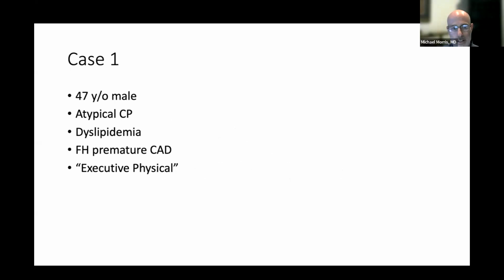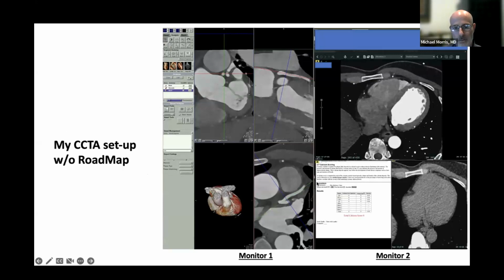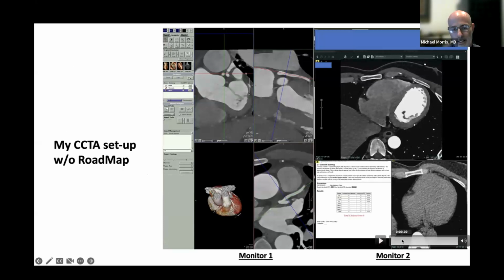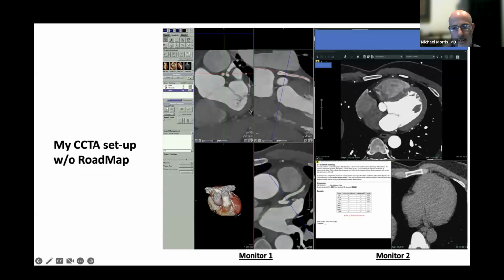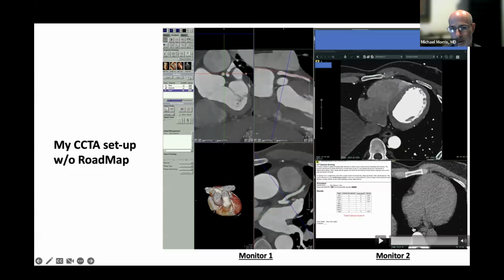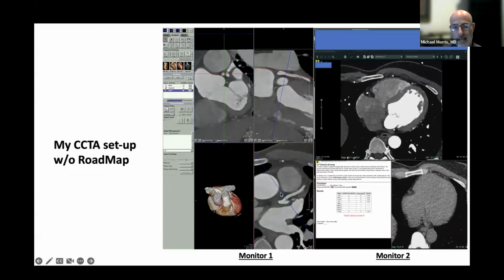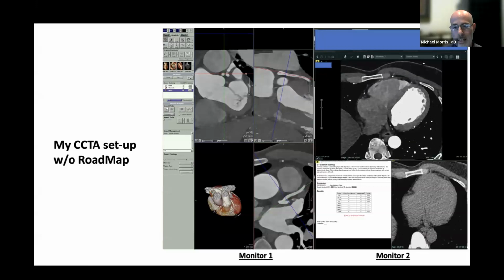And so each of us have our own way of reading coronary CTAs. This is my default for how I start. I first look at the calcium score. Unfortunately, the video is not playing here. And then after that, I will look at the axial images and then go on to the post-processing software. Now, in this particular case, if the video was playing, it would show you that his calcium score was zero, which is great. So I'm already feeling good. But nonetheless, it's still important to review the MPRs, you don't want to miss an occult significant stenosis from non-calcified plaque. So that's the way that I was reading coronary CTAs prior to the implementation of RoadMap.